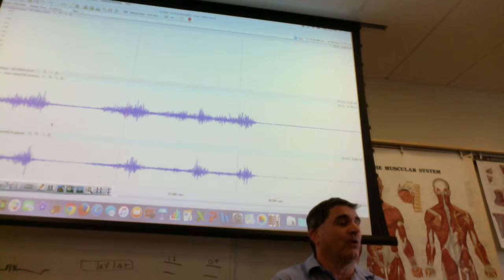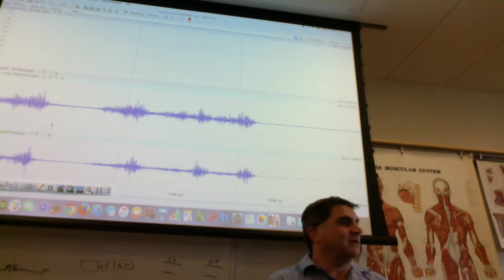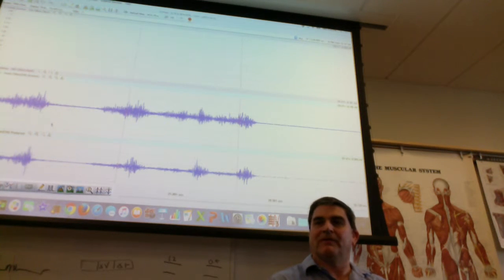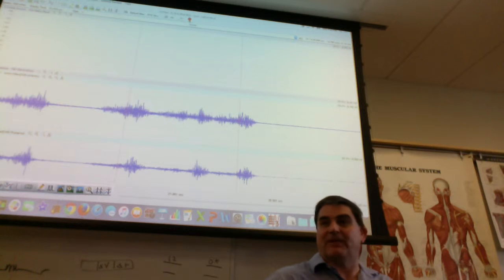So you're going to hit record, and then you're going to start doing this. You wanted to make it so that we can easily see where the flexion is and where the extension is. So what you should do is do a flexion, wait a second, do an extension. Wait another second, do the next flexion, wait a second, do the next extension. That way when we look at your recording, it's really easy to see where the flexion is, where the extension is. All right. So when you get ready, just hit record and then go through a series of flexion, extension, flexion, extension, flexion, extension, putting a second or so between everything.